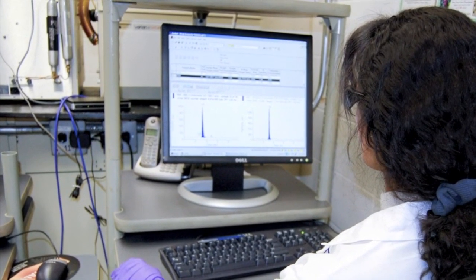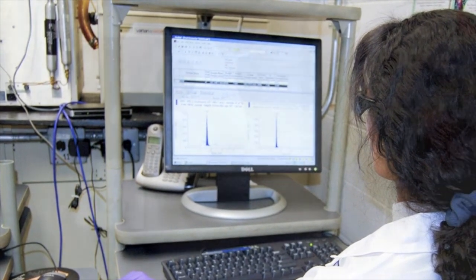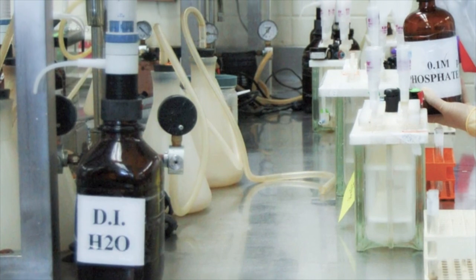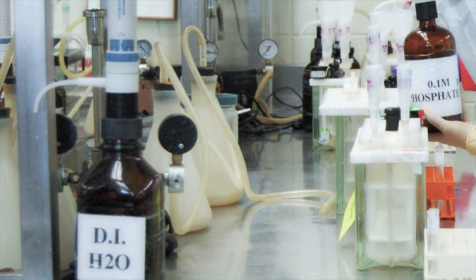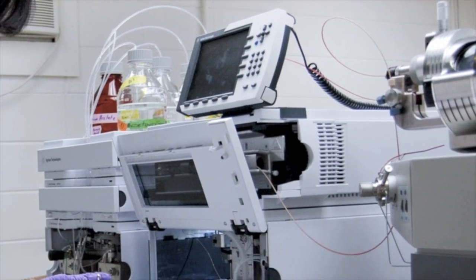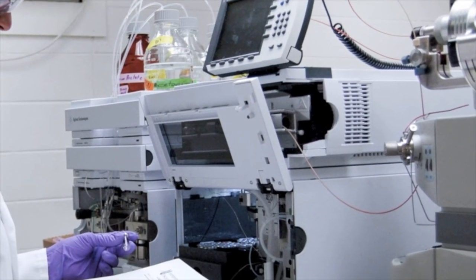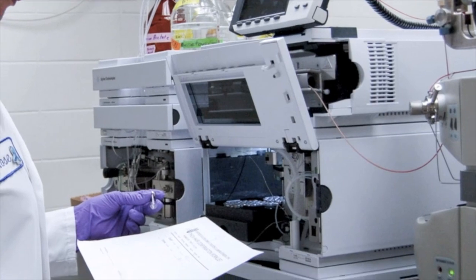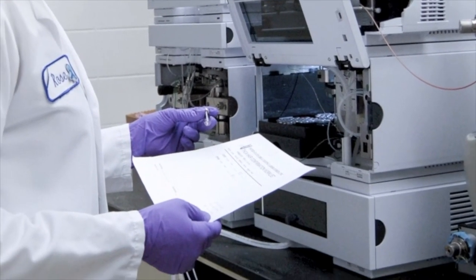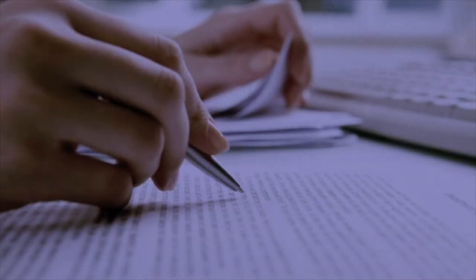After acceptance of the initial testing data, the initial negative certification reviewer generates the final toxicology reports for all of the negative specimens. This individual verifies each field on the report. Lastly, a final negative certifying scientist executes the final review of the negative specimens and releases those reports to the client via fax or email.